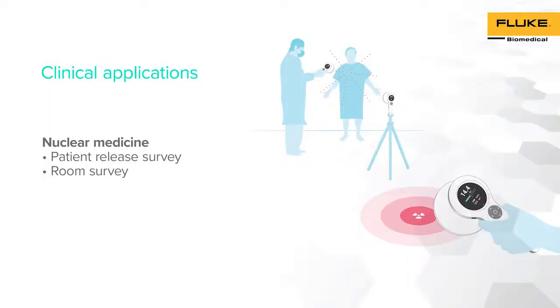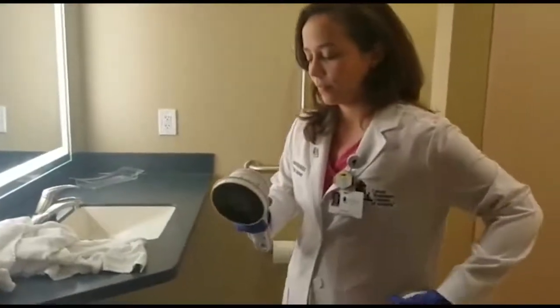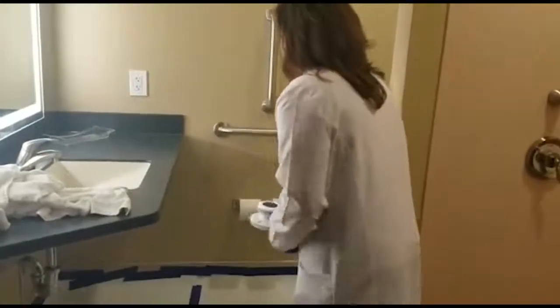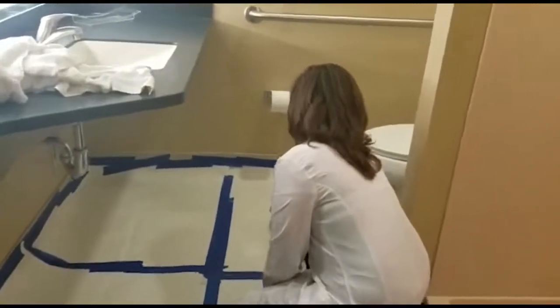RACE-A 452 has multiple applications in nuclear medicine. We will show how this versatile survey meter can be used for patient release surveys and room surveys. To perform a patient release survey, change the RACE-A 452 into exposure mode by placing the gray lid into the instrument. After a few seconds, you are ready to start collecting measurements. Stand one meter away from the patient and place the effective point of measurement towards the patient. To perform a room survey, remove the lid and use the detector in Geiger-Müller mode. Perform the survey and identify the area of contamination. Remember that the radiation limits and audio can be modified in the device settings.